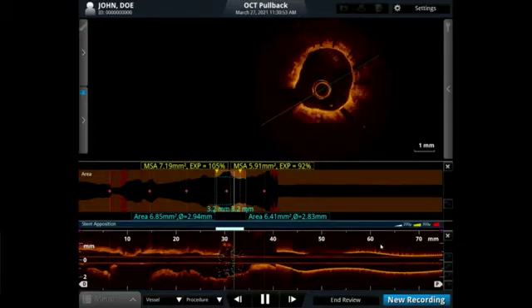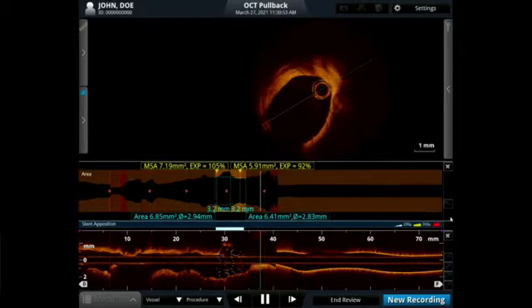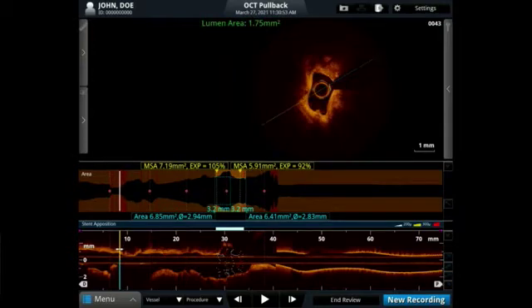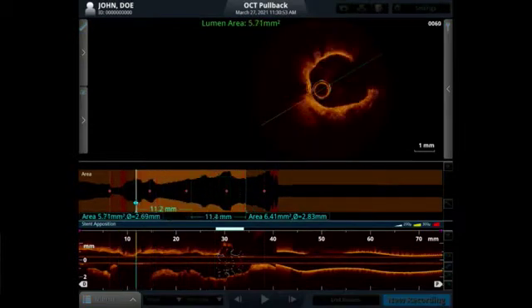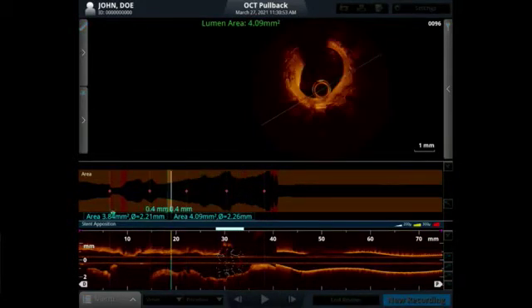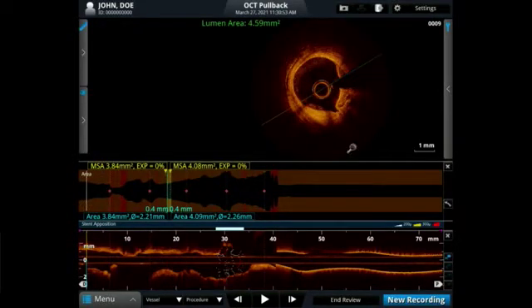So I'm just going to do my measurement here for a sec. In all cases, what I try to do is first put my marker into the lesion, move the posts inside to see my landing zones, to see what I'm going through. Obviously, in this case, because it's ISR, it's good to define what we're dealing with. I'm starting distally here. If you look at this spot, it's a semi-good area to land. The reason I'm saying so is you have at least 180 degrees of relatively normal architecture of the artery. You can see the intima, the media, and some adventitia here.